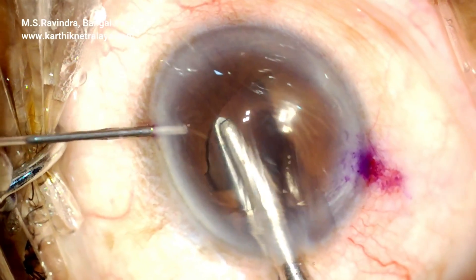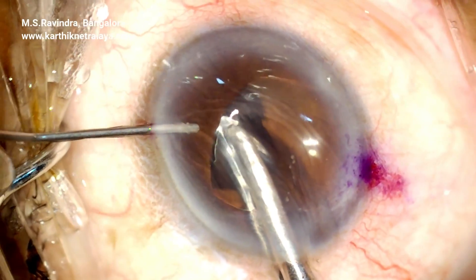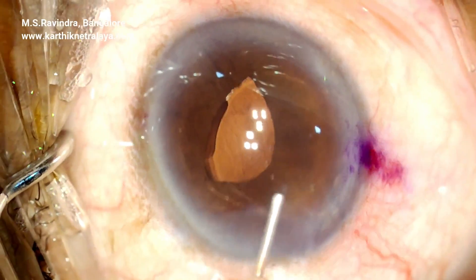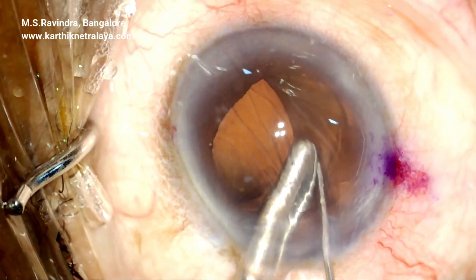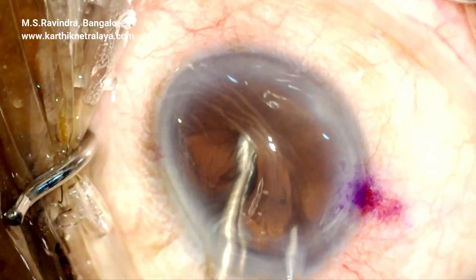There is no vitreous loss. The anterior hyaloid face is intact until now. The haptic is lifted up and the iris is enclaved into the slit using a 27-gauge straight cannula, which is passed obliquely to the iris.